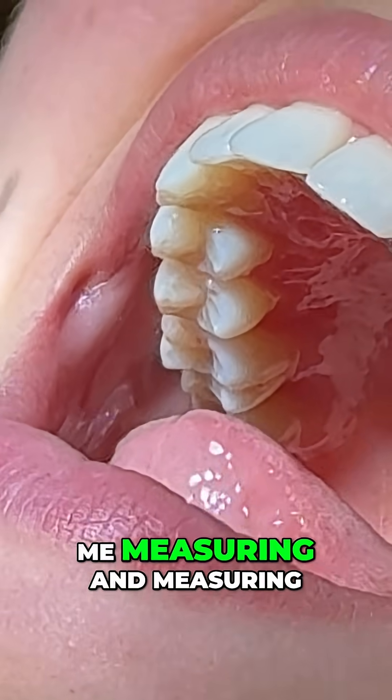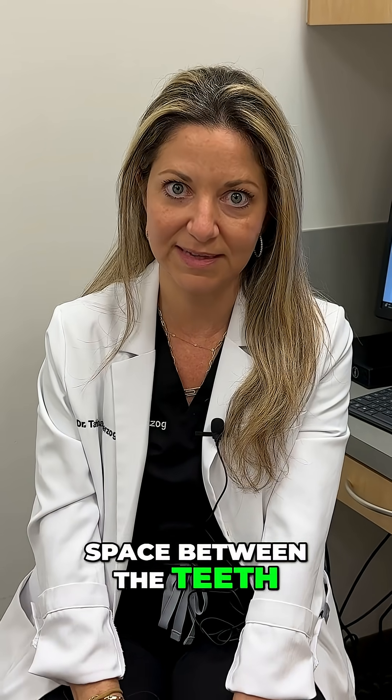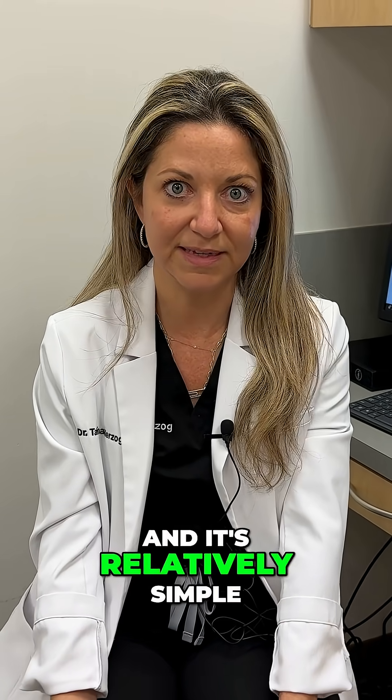And then you'll see me measuring until I get to the perfect thickness and space between the teeth. This procedure does not hurt. You don't need any anesthesia for it. And it's relatively simple to do.